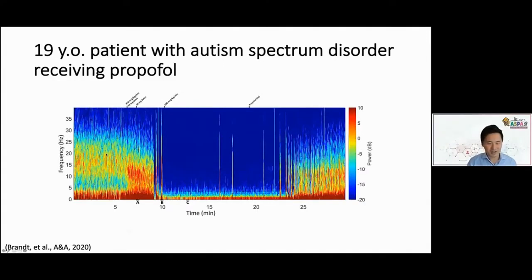So initially, there's the midazolam plus ketamine. So it's, again, that combination of beta oscillation you might get with midazolam, right? It's a GABAergic agonist. So for sedation, you get this. Ketamine also kind of produces activity in this beta range. So this seems reasonable, not surprising. There's some slow delta oscillation here too. So this patient might be quite sedated at this state.